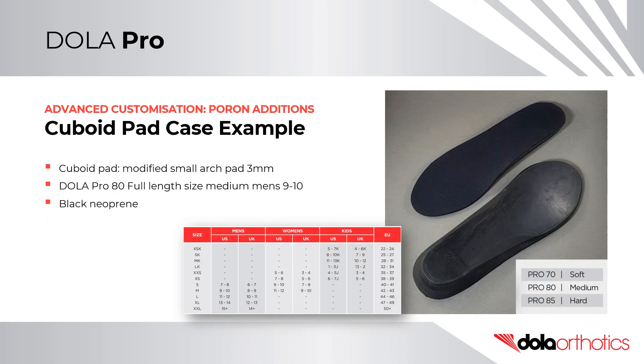In this case example, a size small Poron arch pad was selected for the cuboid support and was placed on a size medium DollarPro 80 medium density full length orthotic shell. A Poron arch pad was selected to cover a larger area of support compared to a modified metatarsal dome option based on the foot size. The full length DollarOrthotic Pro is available in three densities — soft 70, medium 80, and hard 85 — across 11 sizes from a kids' size 5 to a men's size 15 plus.